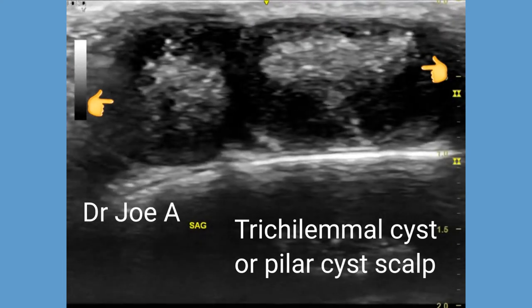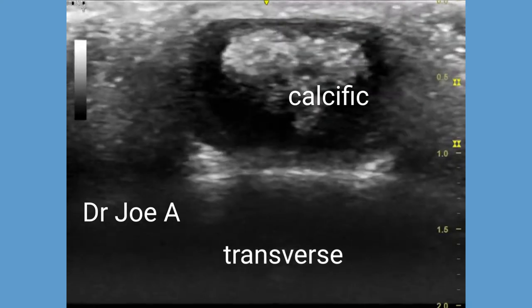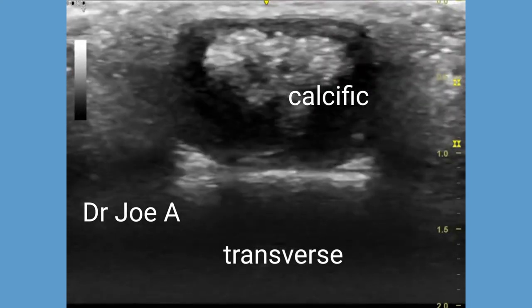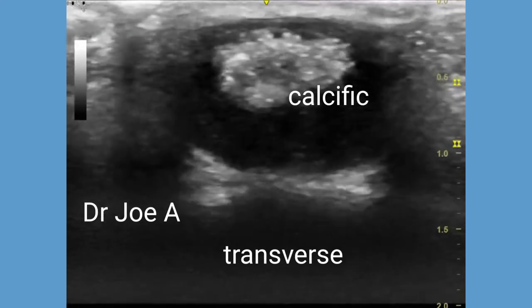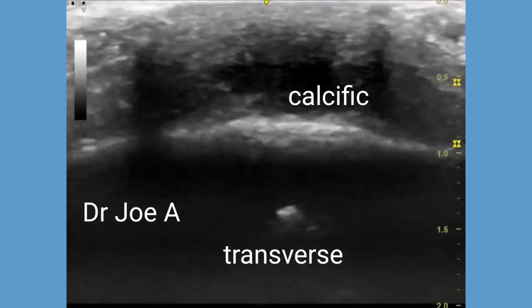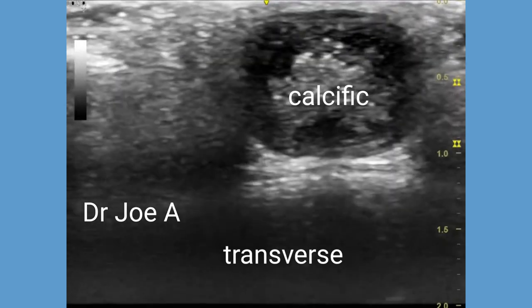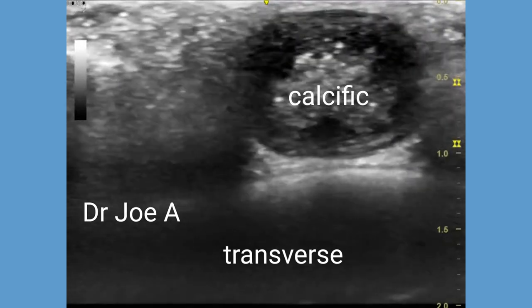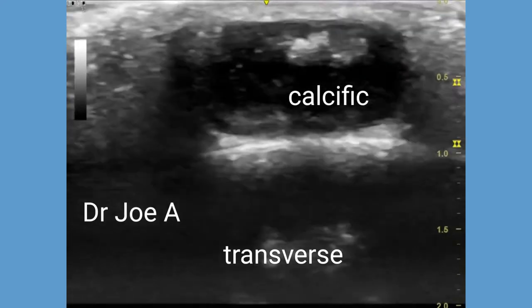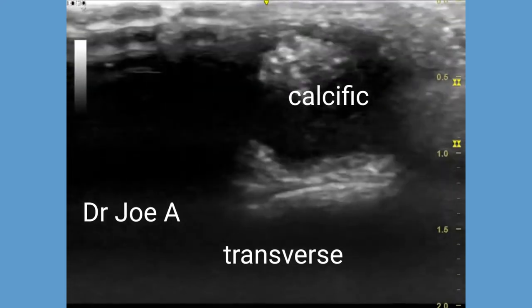A trichilemmal cyst, or pilar cyst, is almost always benign. This must be differentiated from a sebaceous cyst in that this cyst does not have a punctum. A sebaceous cyst, by contrast, originates from the sebaceous gland of the scalp.